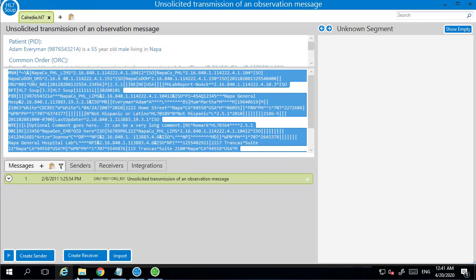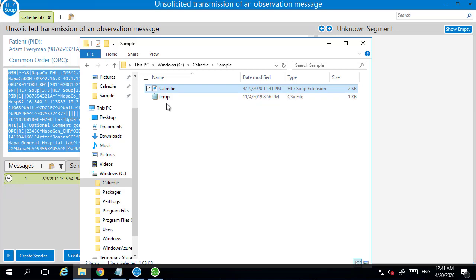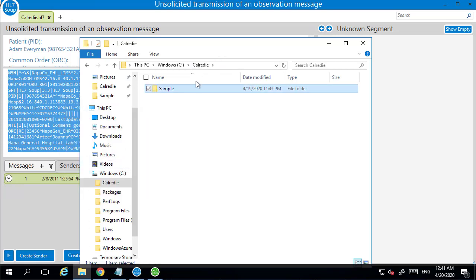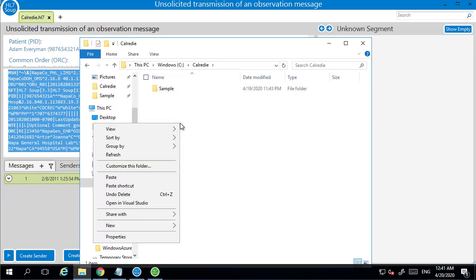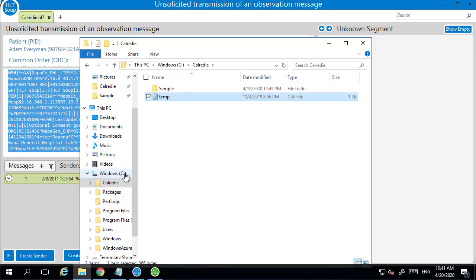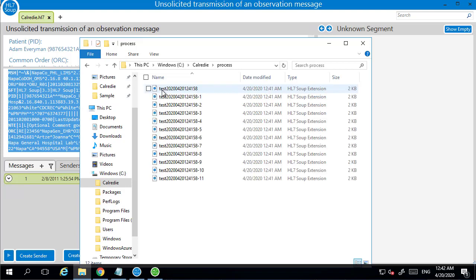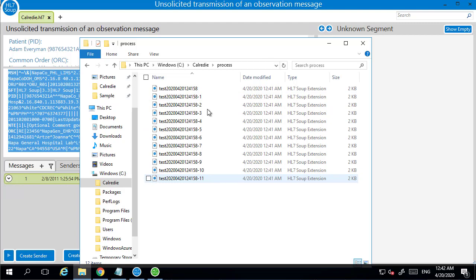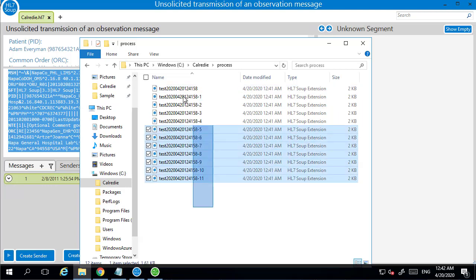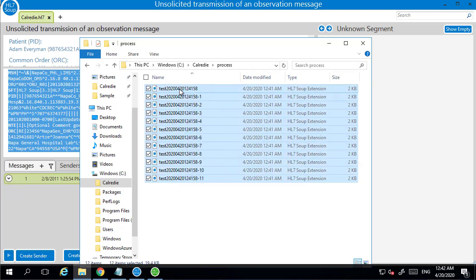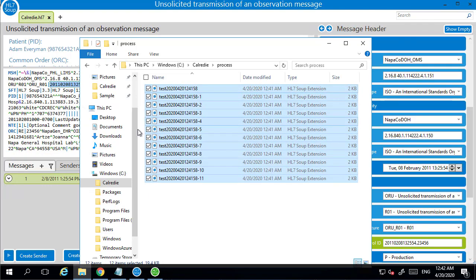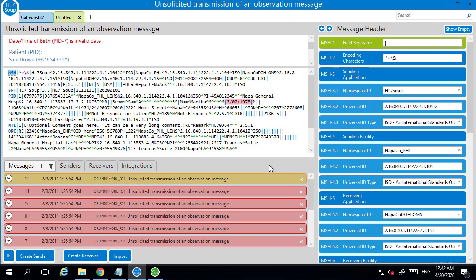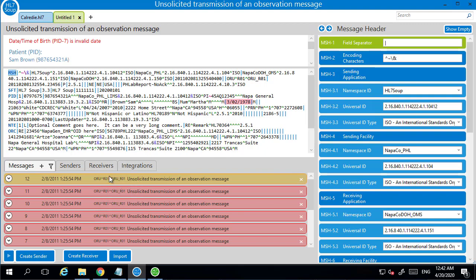So I go back to my sample directory, and I'm now going to take that temp file, copy it back up to there, and I'm just going to paste that into here. And notice it's now created that process directory that I specified, and it's created 12 messages with a unique filename, each of those representing all the items. There were 12 items inside that CSV file. So if I take that and I'm going to drag it over into HL7 Soup and merge those files in.